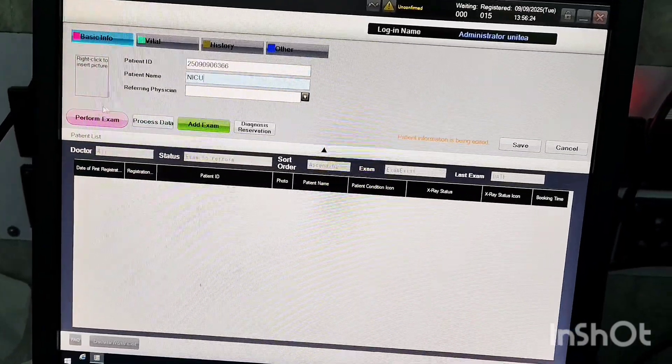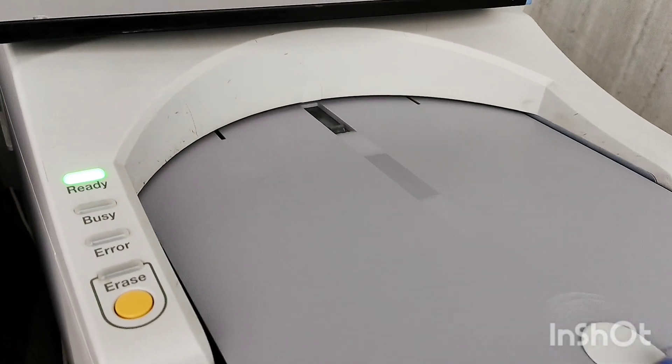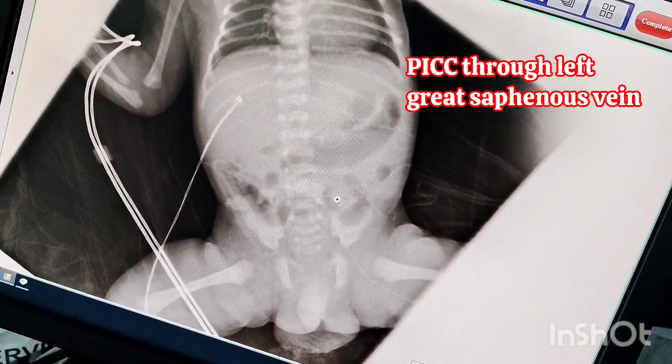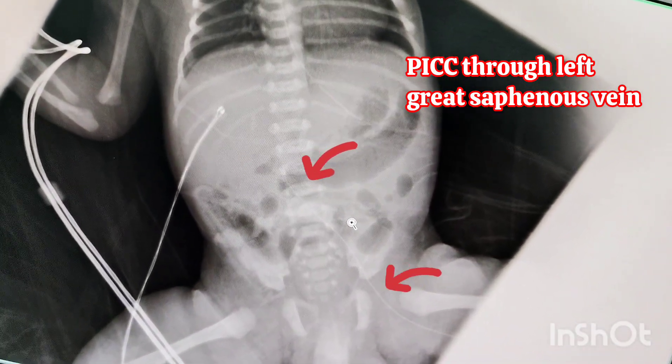A common mishap during PICC insertion in the left great saphenous vein is the line wrongfully entering into the renal vein. Ideally, the tip of the PICC line should be at the level of T9 to T11, but due to the short length of this PICC catheter, it cannot be advanced to the upper level.